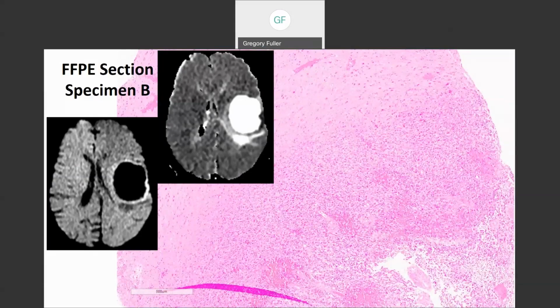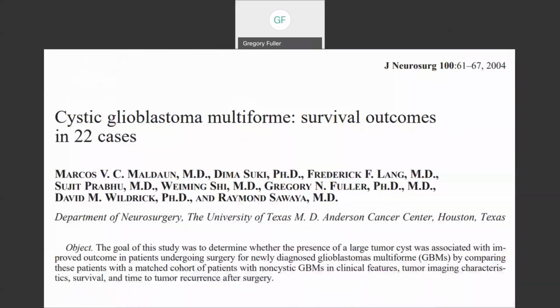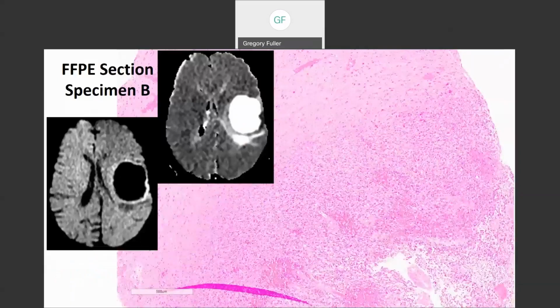It's glioblastoma, right? But there's a relatively sharp margin with the tumor. In other words, there's a relatively narrow zone of infiltration, and you put that together with the pre-op imaging, which was mimicking a circumscribed tumor, JPA, PXA, ganglioglioma.